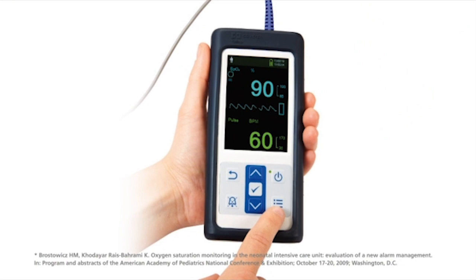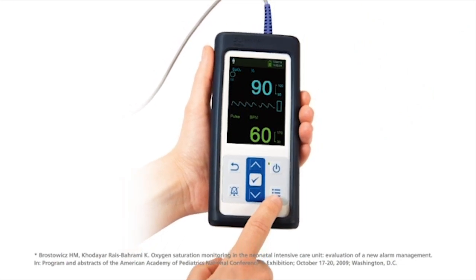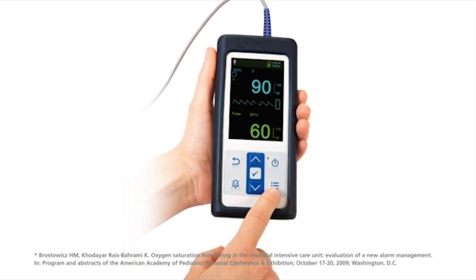The PM10N incorporates an alarm management system that analyzes SpO2 events to avoid triggering alarms unnecessarily. This alarm technology, Nellcor SatSeconds, is used to reduce nuisance alarms.